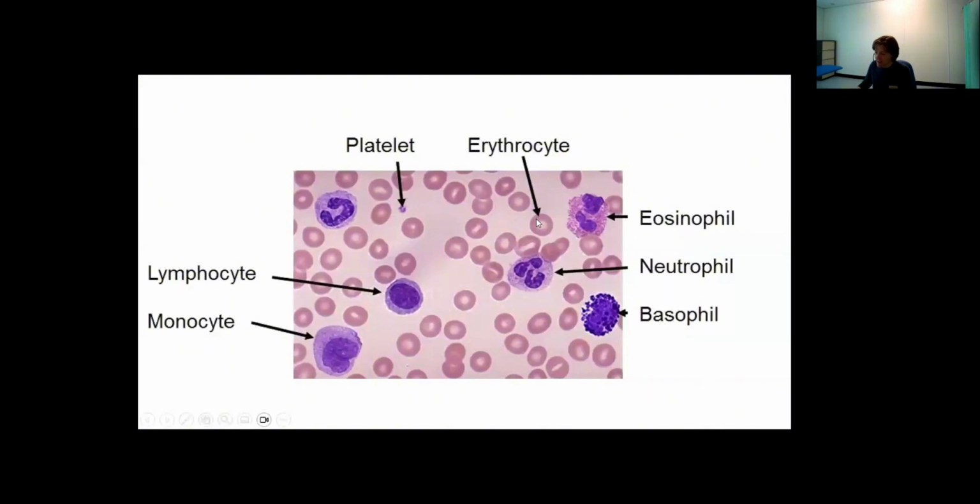So obviously we talked about the red cells or erythrocytes last time, the biconcave discs. I'm not really going to touch on platelets much today, but we're talking about the lymphocytes, the neutrophils, the multilobated granulocytes or neutrophils, basophils, said as such because they have these dark granules which are basophilic.